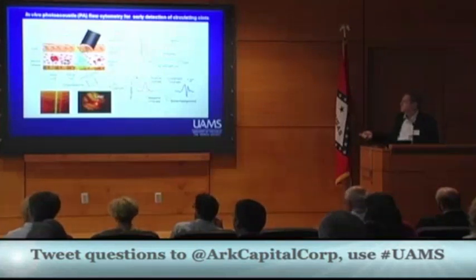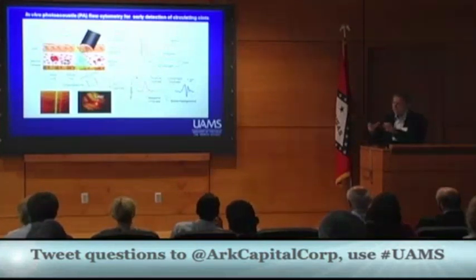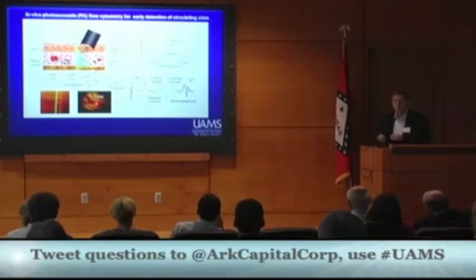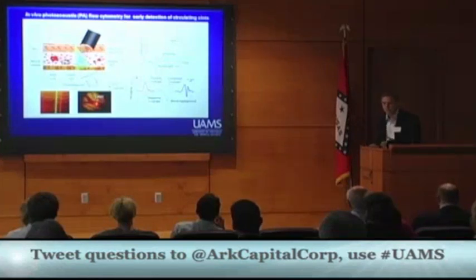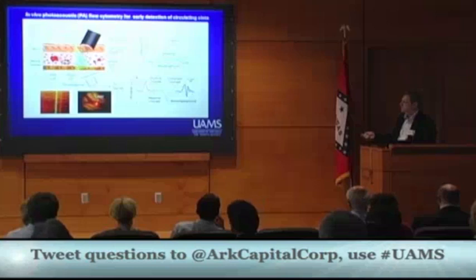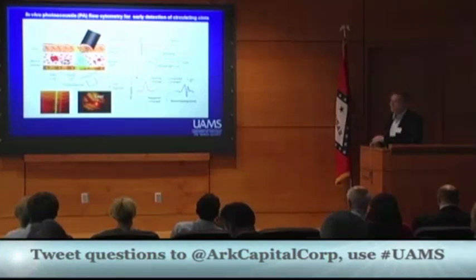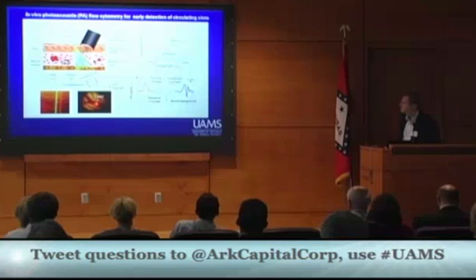This is a typical signal. When a lot of cells are together, red blood cells, erythrocytes, they produce positive signals. We can detect aggregation. If we put some drug, we see disappearance. We can do drug screening, drug efficiency screening very fast. It's real time. When you see negative signals, amplitude gives information how big the clots circulating across the laser beam are. When mixed, it's composition, red or white clotting.